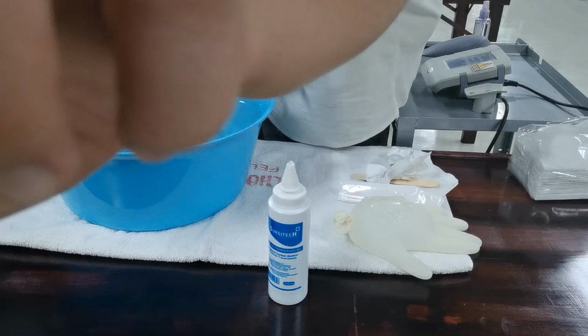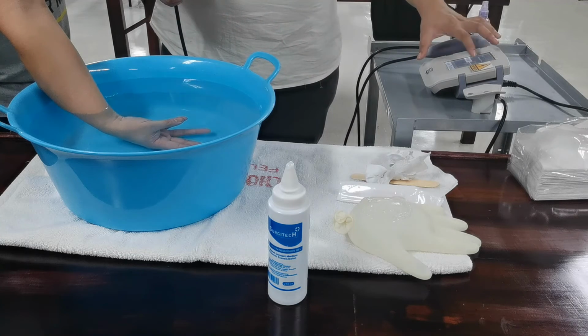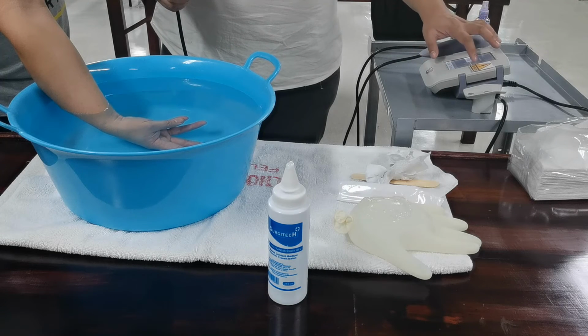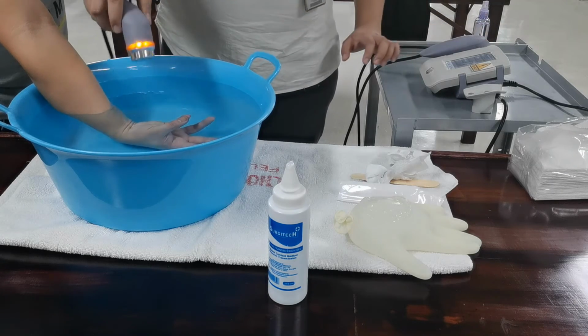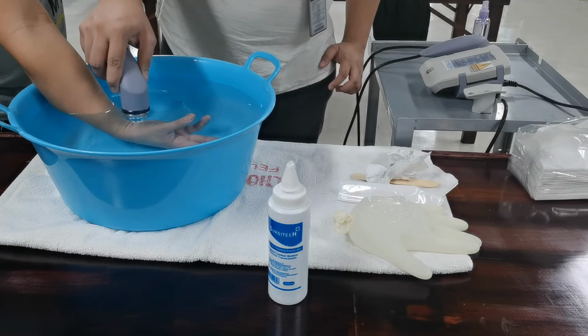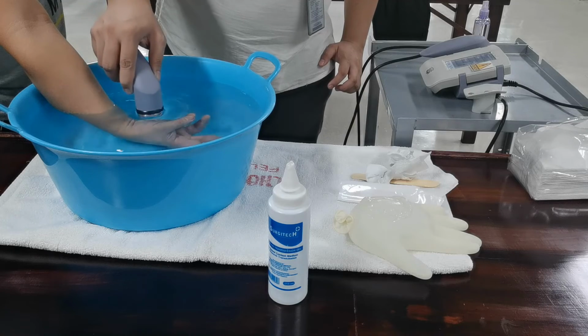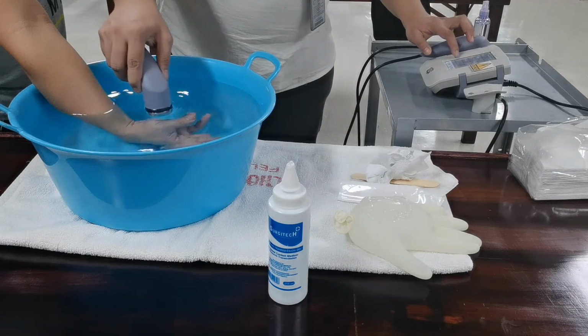Next would be the immersion technique. You fill a basin with water. Make sure the water is lukewarm. This is usually performed for patients with carpal tunnel syndrome. You immerse the limb underwater, and then you ask the patient to oppose the thumb and the small finger to open up the carpal tunnel. And then when you perform the treatment, make sure that only the head is immersed in water.